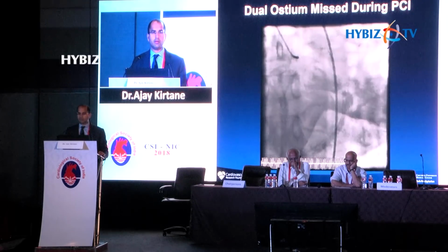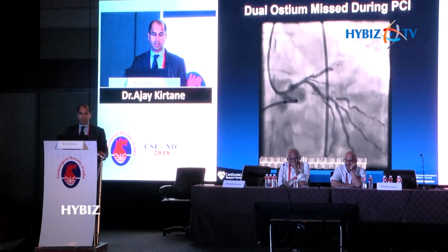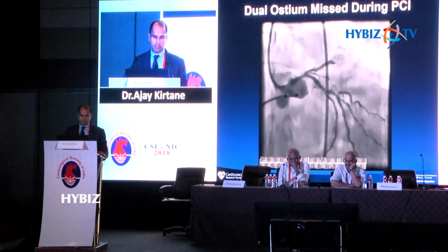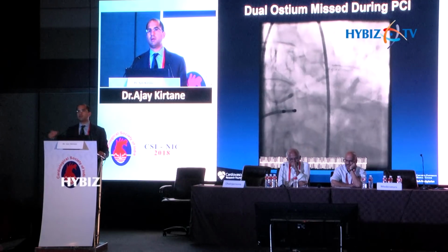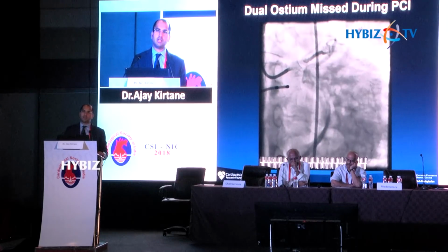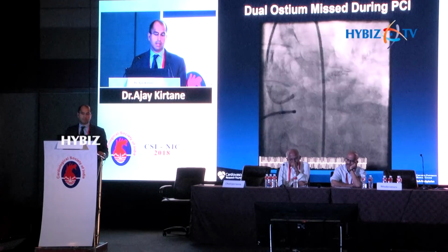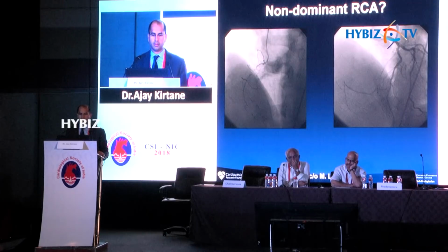I tried for a while to engage it, but was not able to. The patient ultimately arrested, they were having an MI, and now when the patient's arresting, you can see, I'll show you here, this is the circumflex, and that's the LAD filling from a dual ostia. So the reason the patient was sick was because they had occluded their LAD stent, but I thought I was in the left main. Instead, I was subselective in the circumflex, and therefore I could never actually wire the LAD. And this patient, unfortunately, was in cardiogenic shock and did not do well as a result.